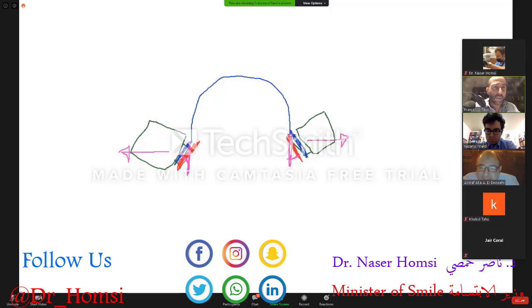Thank you for your question because it allows us to go into deeper consideration in this case. In this particular case, the tooth was quite proclined, and we were able to reach from a lateral point of view the center of resistance because the cantilever had an inward bending, and it's not easy to see from this perspective, but I want to help myself with a drawing.